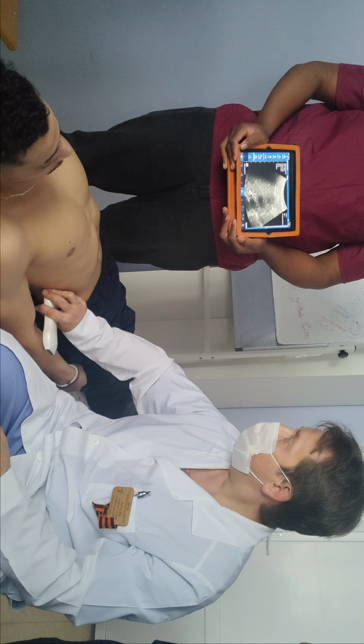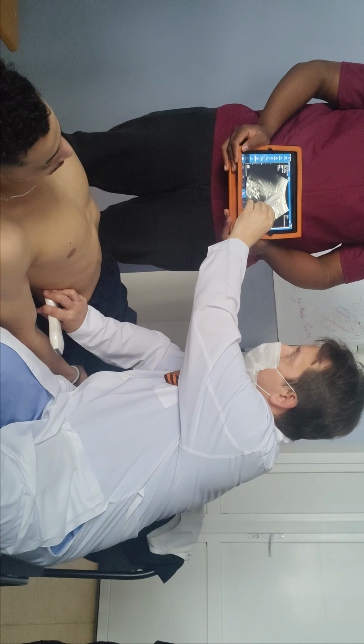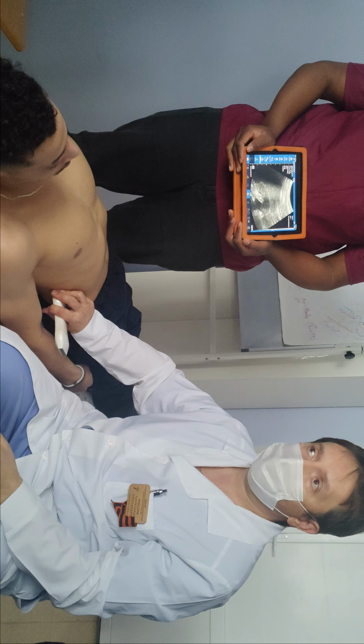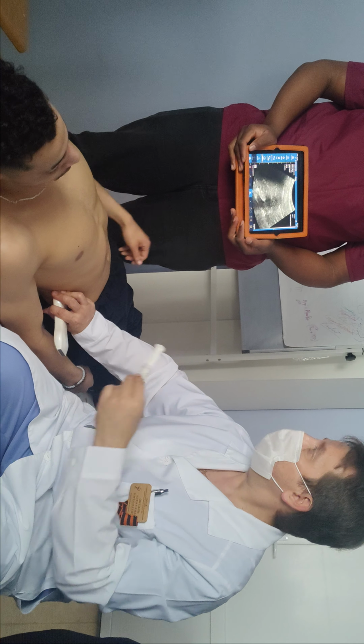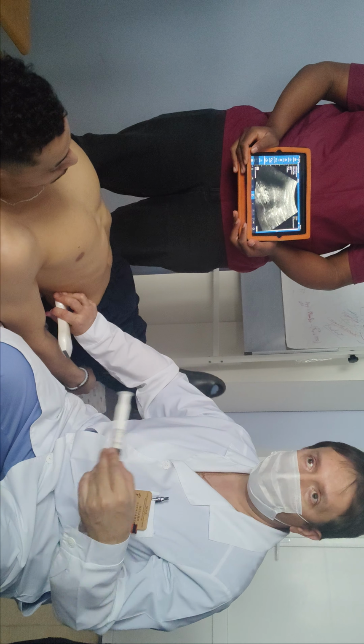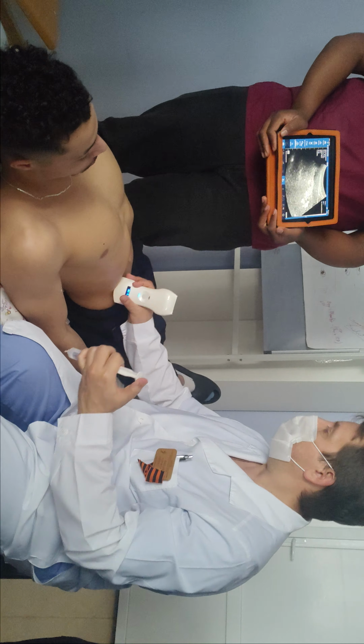And here we have two organs, but it's still good for understanding and overview. It is a kidney plus hepatic zone, without lung tissue, but at least two organs together must be glued. It is our main purpose. Catch? Yes. Okay.